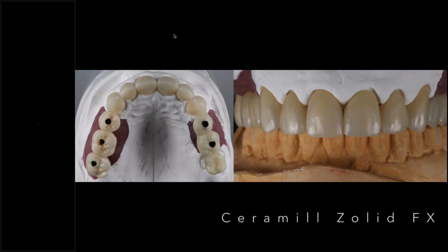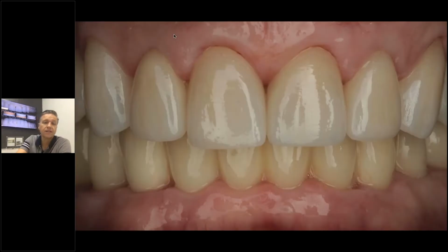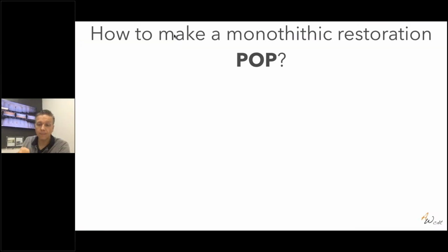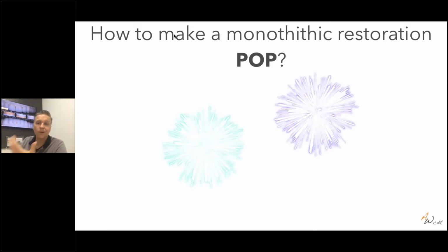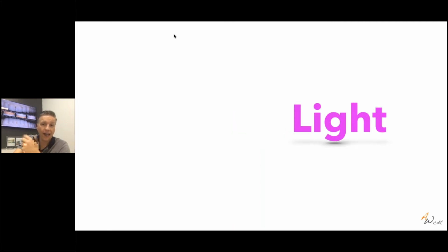And that's the same case seated in the mouth. Now the lower is in temporaries, so that's the next step we're going to do. So how do we make a monolithic restoration pop? And by pop, I mean, what are we utilizing to make that restoration look natural with these effects? These effects are usually built out of light. Light is a very important effect, and texture.